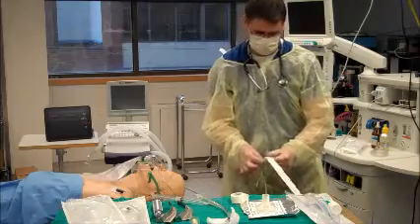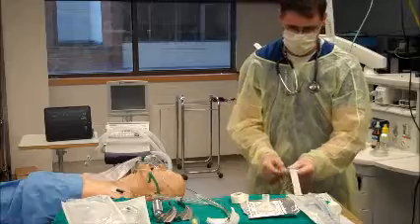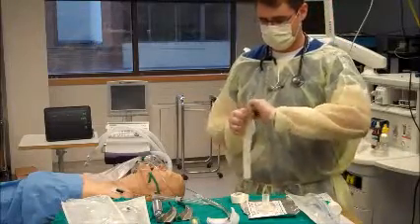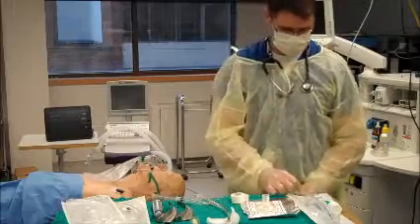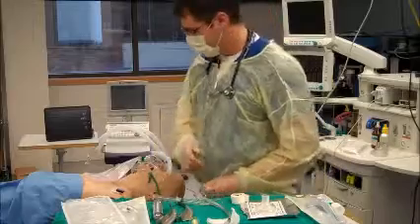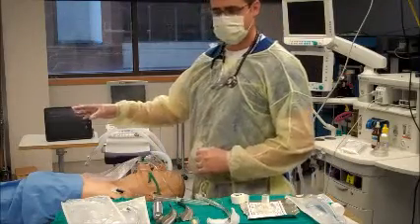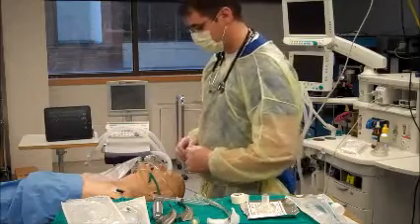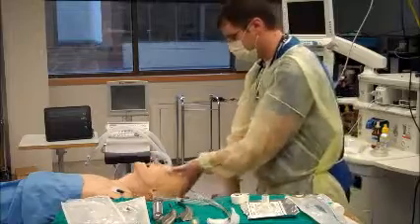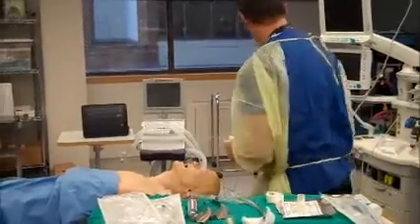We'll show you how to do this in a lab. That's my prep for securing my ET tube — make sure that's accessible to me. When my assistant or physician is starting to pre-medicate the patient and the patient is becoming ready for intubation, I'm going to remove the non-rebreather mask and ensure that my suction is on and ready.